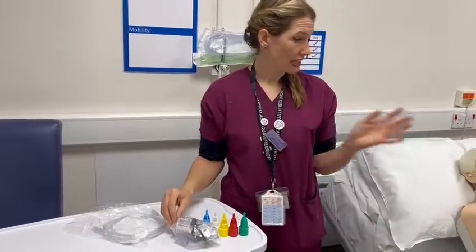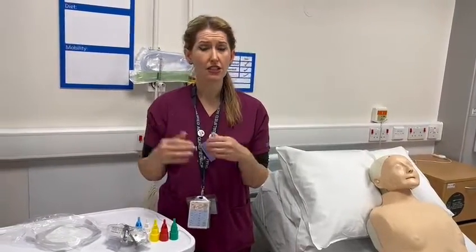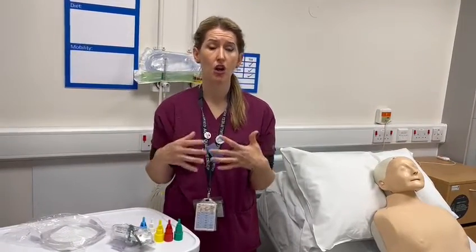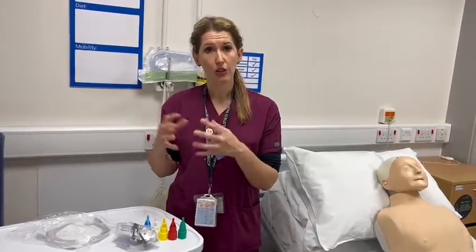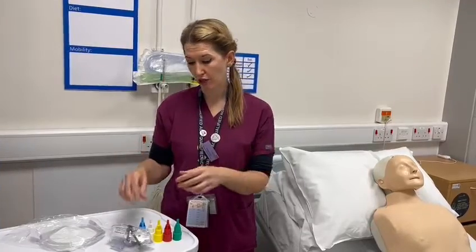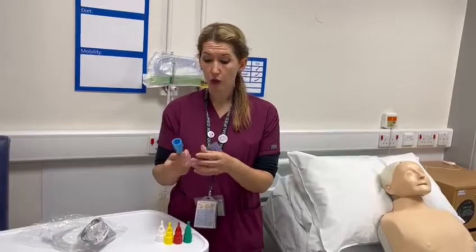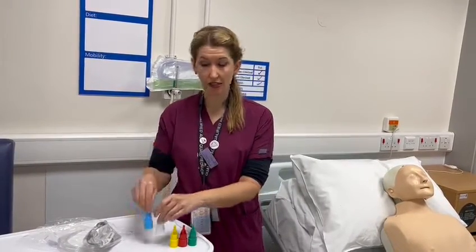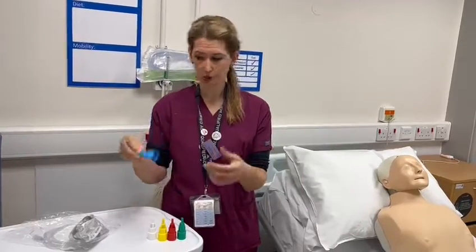We've got a patient here who has just dropped their SATs down to about 92–93%, and they have a target range of above 94%. So we just want to give them a small amount of oxygen to get them up to within range while we await our medical review. The options I would typically go for would be a 24% or 28% to start off with, so for the purpose of this video we'll start at 24%.